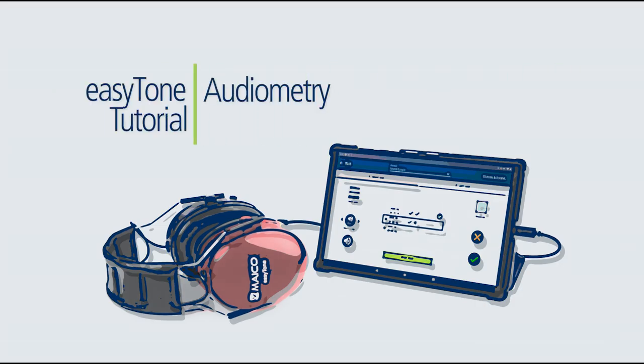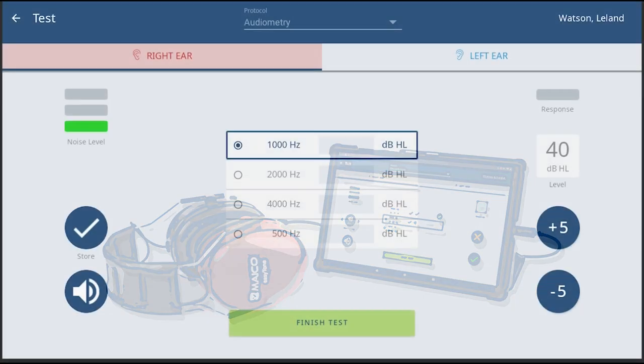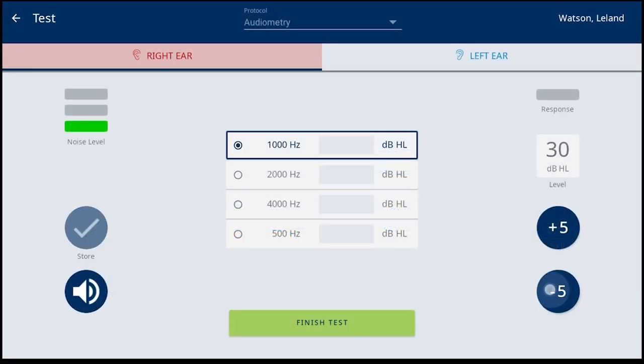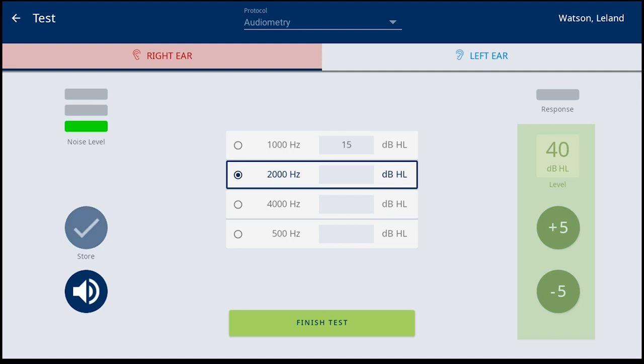The second method allows the screener to adjust the level before presenting the tone. This is typically used when a threshold level is necessary to complete the screening.